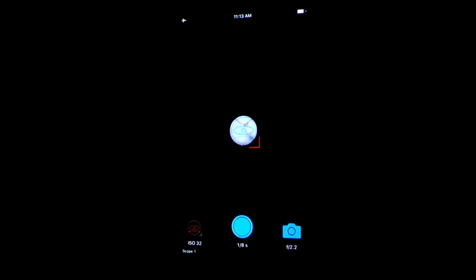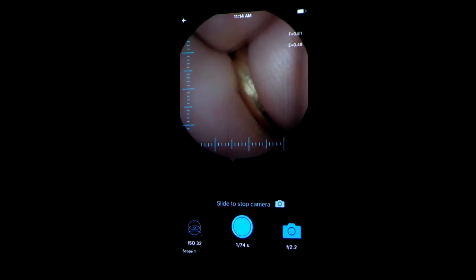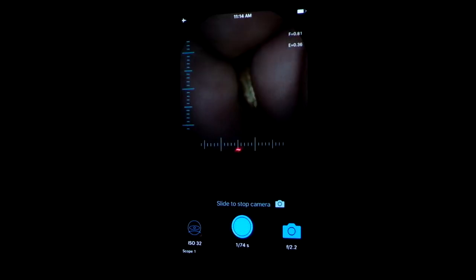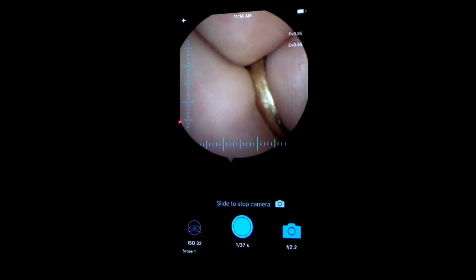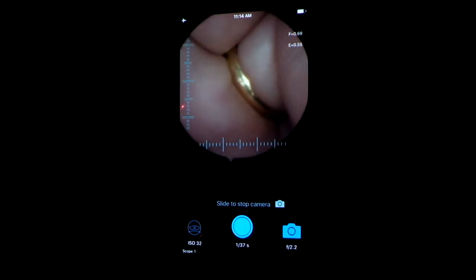It's best to have it overlap with what your scope is looking at, and then once again hit the red eye in the lower left-hand corner to bring your image back up. The other two controls that are important to you: the slider at the bottom of the screen controls light intensity, and you'll need to adjust that as you go into a darker ear, pulling it up or down. The slider on the vertical side takes you into or out of focus.